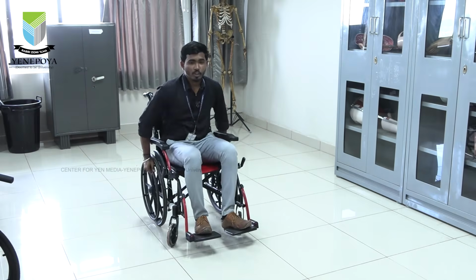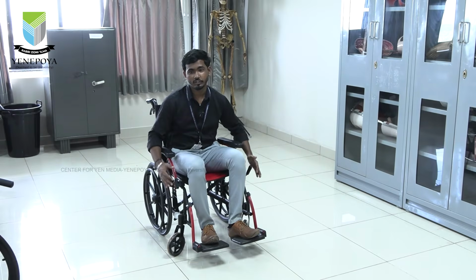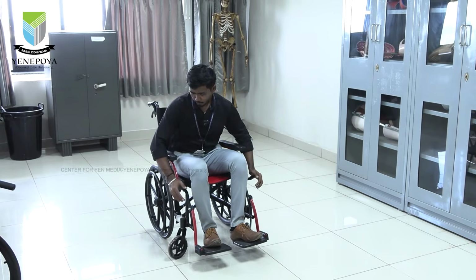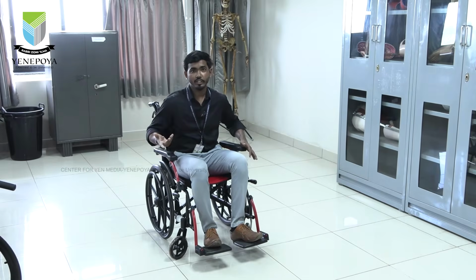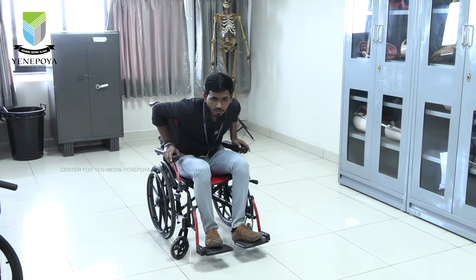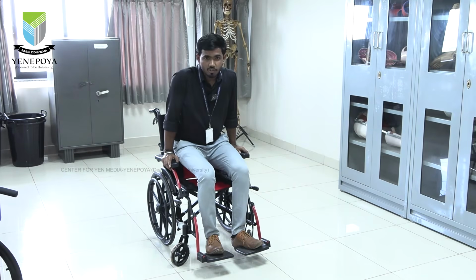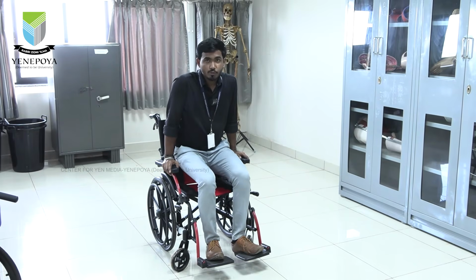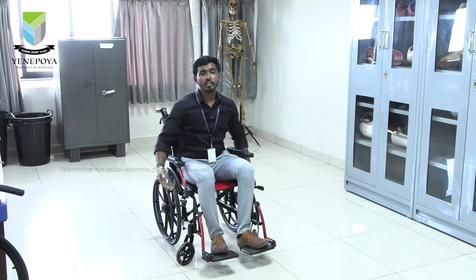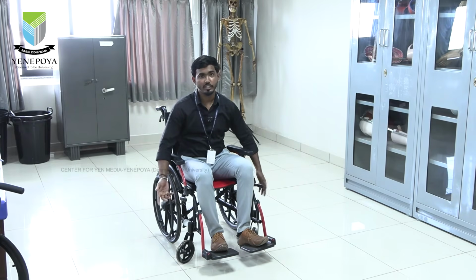After this, one of the main things spinal cord injury patients will use: because they will be sitting in the wheelchair for so long, we have to relieve the pressure. Just put a brake like this, and there are two techniques to do this. If the person has more strength in their triceps and latissimus dorsi, the person can do the pressure relieving technique like this, using only upper limb strength, not any lower limbs, and they have to hold it for 15 to 20 seconds, depending on their need, and do it very frequently so that pressure does not build up, otherwise the person will have pressure sores in their gluteal region.